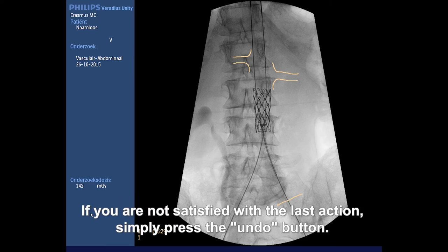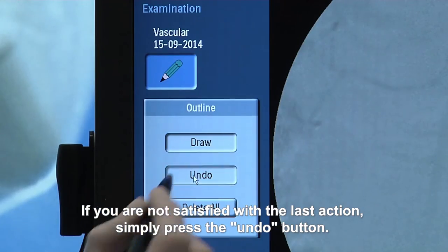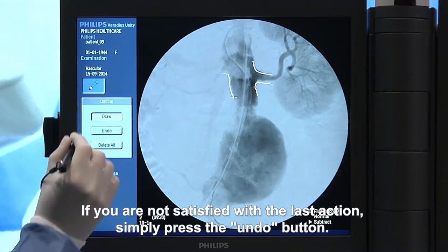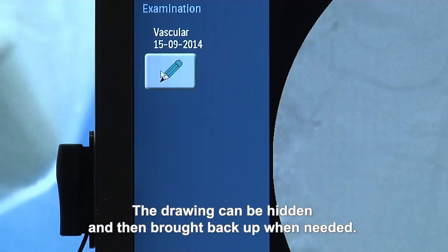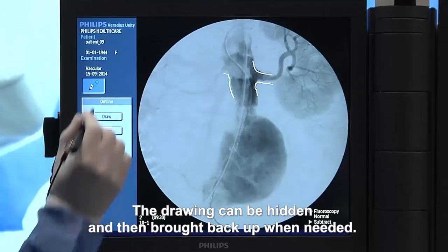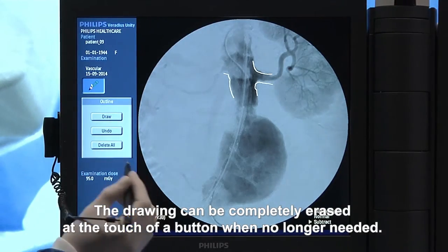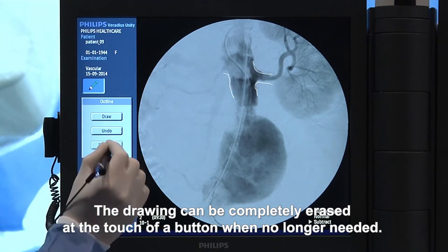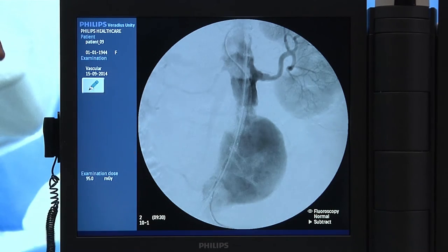If you're not satisfied with the last action, simply press the Undo button. The drawing can be hidden and then brought back up when needed. Or the drawing can be completely erased at the touch of a button when no longer needed.